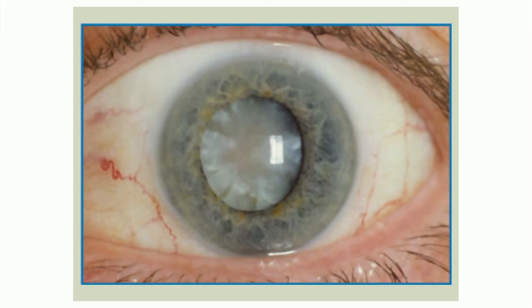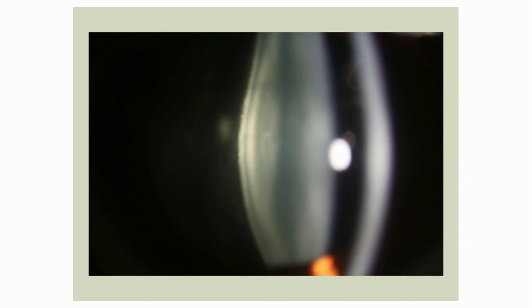And so here's a picture of a dilated pupil. This is your iris. You're looking through a clear cornea, and here's a cataract. So this is the lens sitting behind the iris that's now become cloudy. And this is it looking at a microscope that you're examined at in the office. And here's the light that is getting partially blocked and shows this round clear structure, which is your lens within the eye.